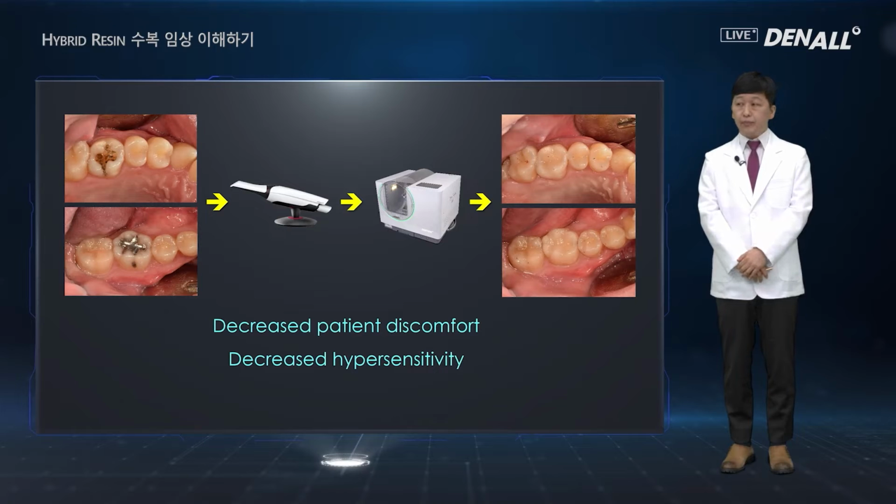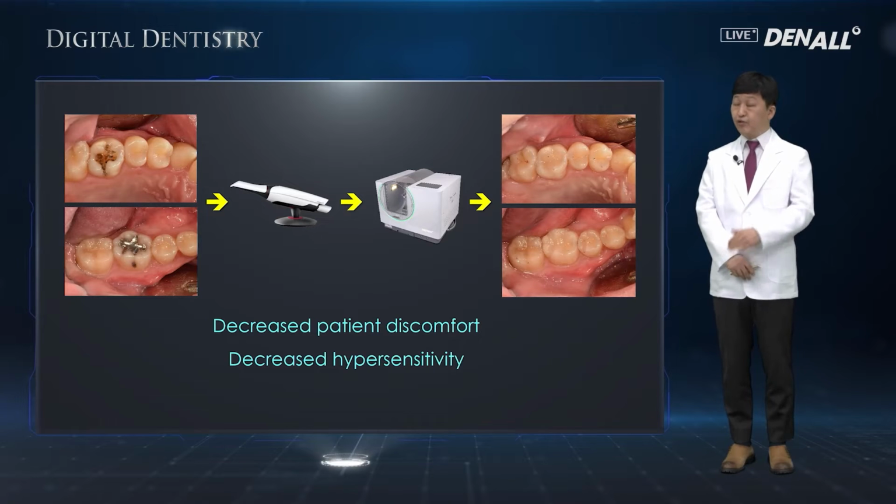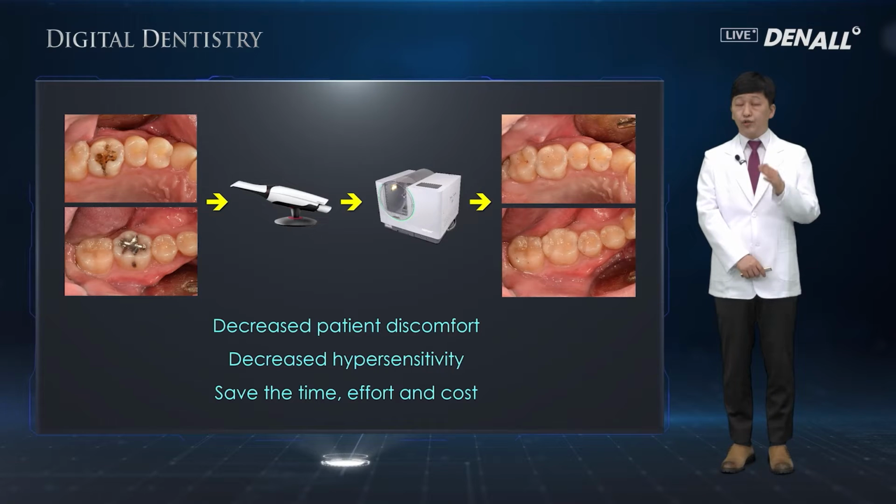Second, the process of temporary filling is out of the question. Therefore, cavity contamination is not a problem. Because of these reasons, hypersensitivity issue goes down. Third, it saves time and effort and cost for both patient and the dentist.